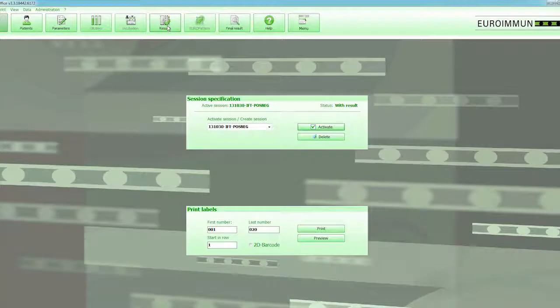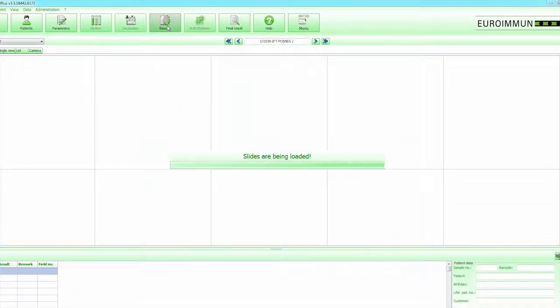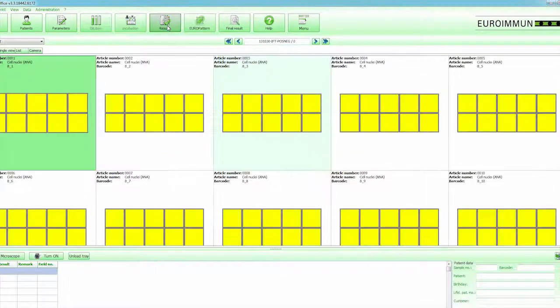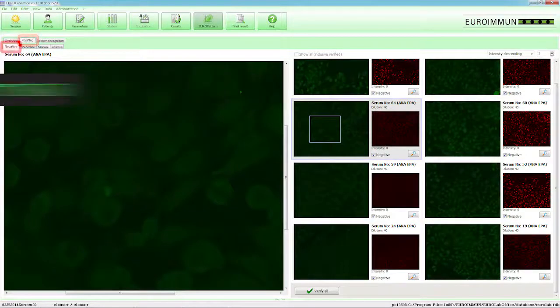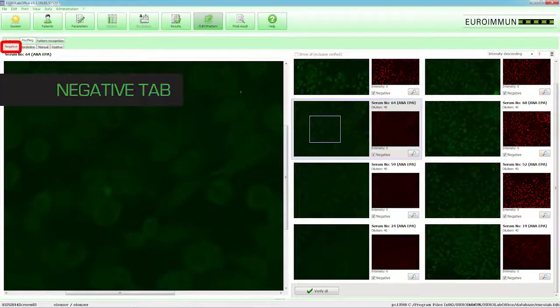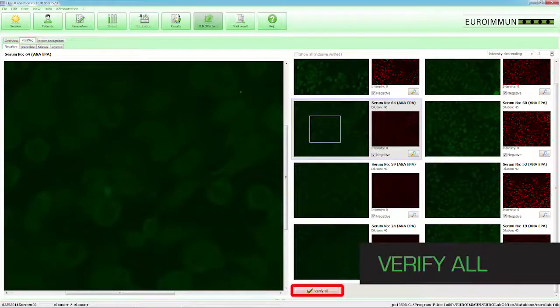Click on the Results button in the toolbar in order to display the overall view of results. In the Positive-Negative tab, all results are batched according to their qualitative results. In the Negative tab, click Verify All to release all of the negatives with a single click of the mouse.